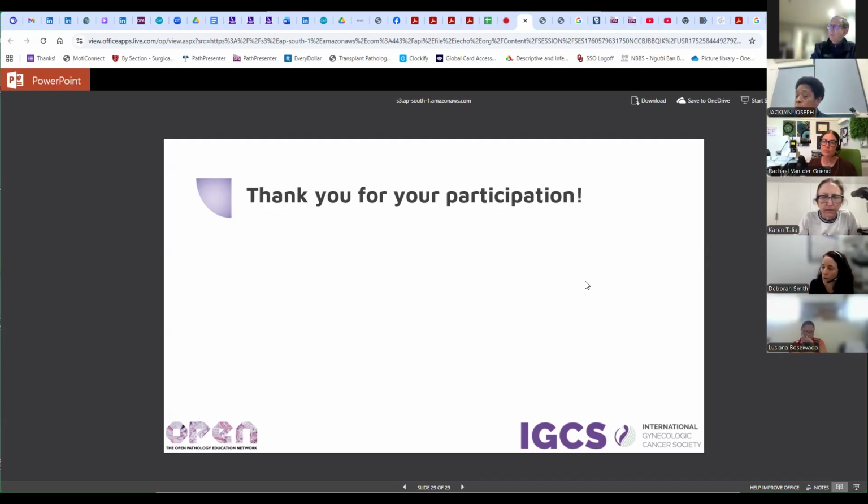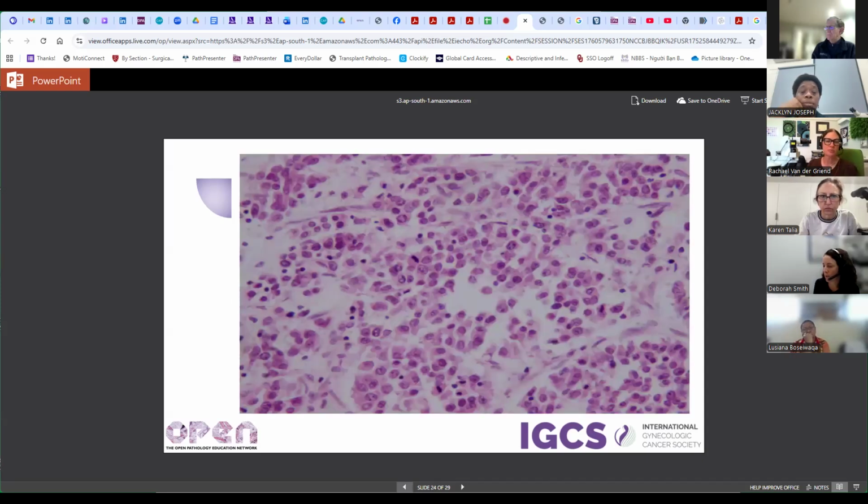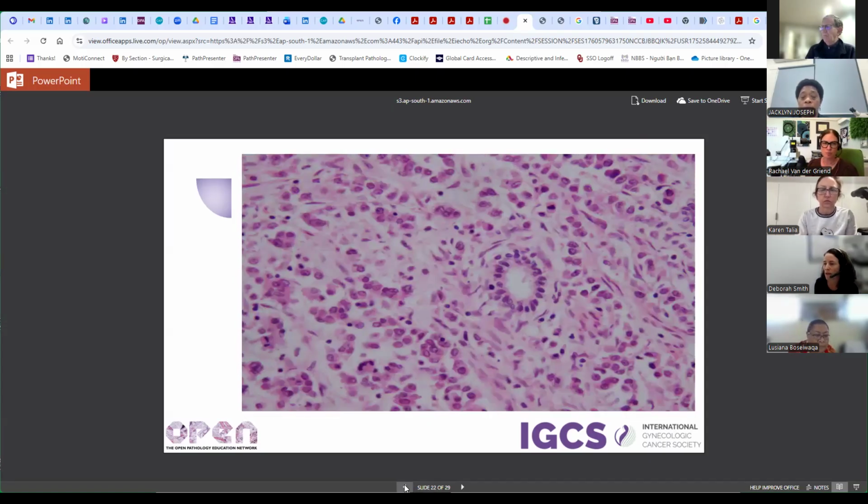So going back up, I agree with Dr. Hahn's email, which I thought was a great summary of a lot of this. But if we go back up into your slides, again, it is a difficult problem without the IHC, partly because for me it looks almost quite necrotic, or poorly fixed, which is really classical for dysgerminomas as well. But obviously it makes it really hard to see the morphology.